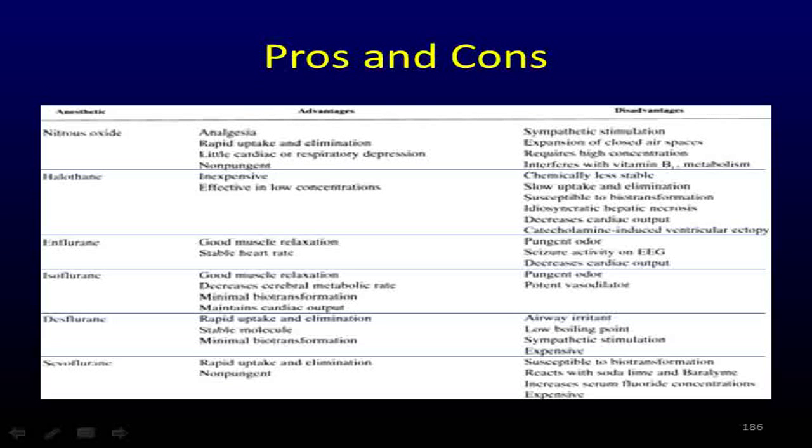So if I'm 1% isoflurane at sea level, how many torr am I? 760. Well, I'm 760. So what torr of iso? What's my millimeters of mercury of iso in that 760? 7.6. 7.6 torr. If I'm 1% isoflurane at 600 millimeters of mercury at altitude, what am I there in torr? 6. So my vaporizer output actually decreases when it comes to sevo and to isoflurane.